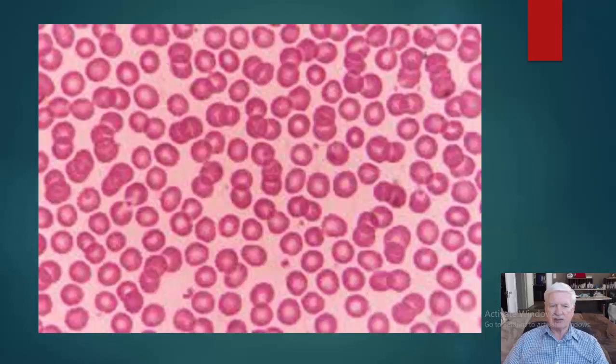This is an actual microscope slide with a Wright stain. We'll see what happens with the Wright stain in a future slide.